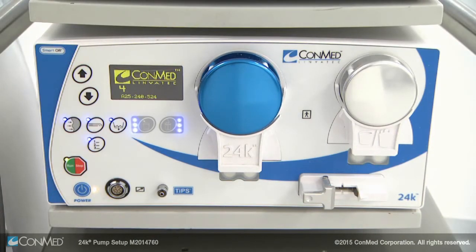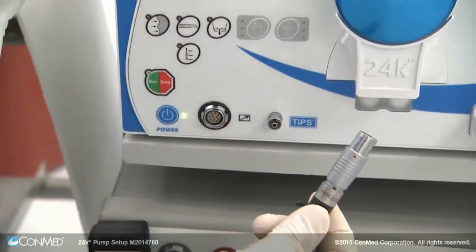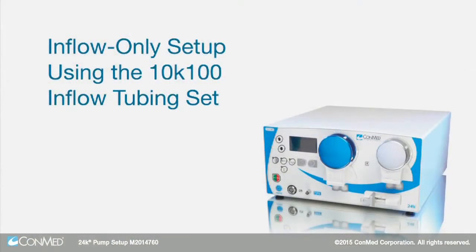Press the blue power button to turn on the 24K pump. The display will show the software loading. You will see two tubing set icons appear. Now you can connect the 24K remote to the pump by aligning the red dots.